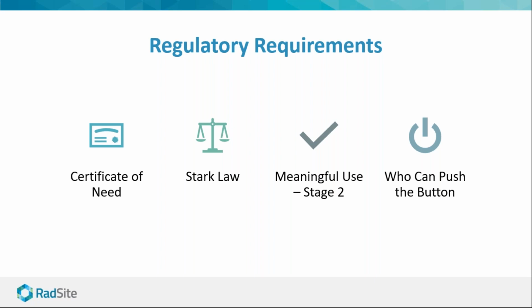Some states really don't have much regulation at all on this subject, which means anyone that is trained to safely operate the scanner can push the button. In some states, you have to have a state licensed, what they call technician, and I would put that word in quotes because that definition varies by state, but by and large, it's relatively easy to get these state licensed certifications. You just have to maybe fill out some paperwork, potentially certify to some competency requirements, some additional training perhaps.